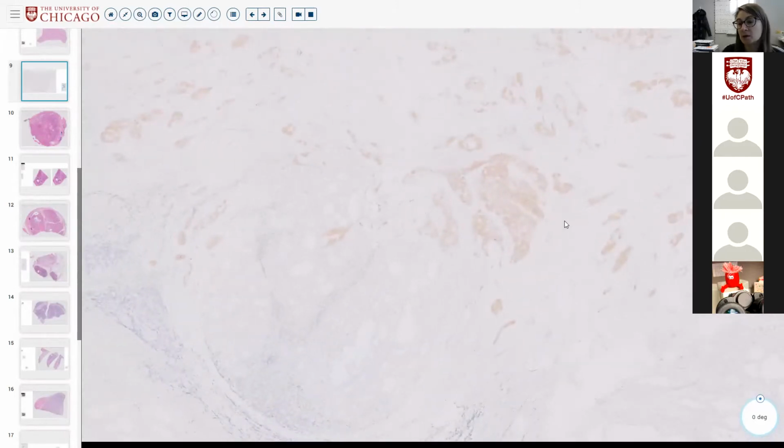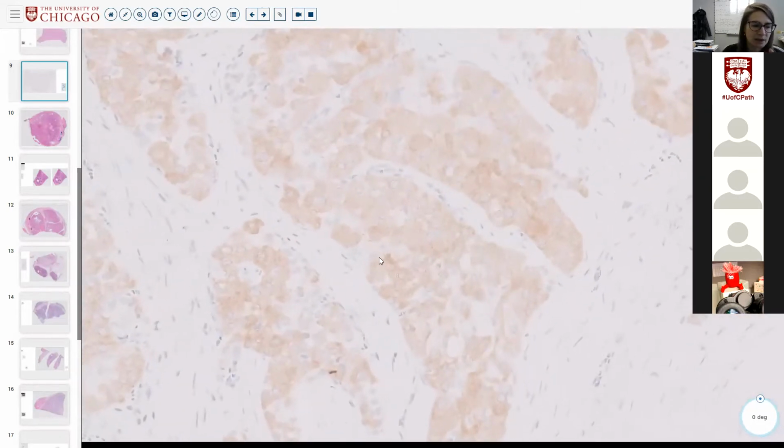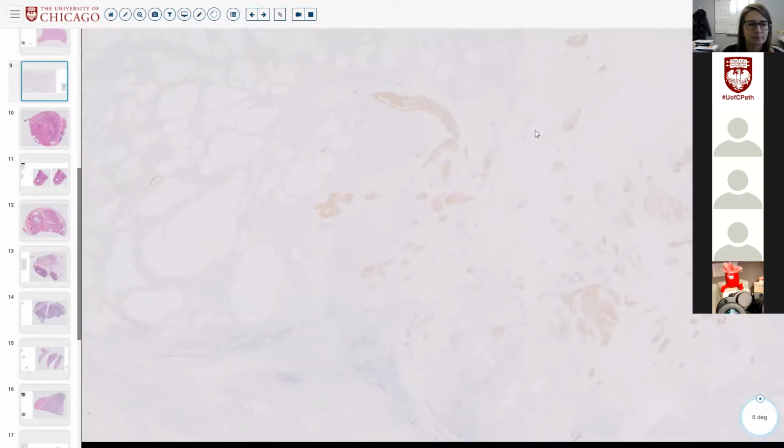I think I saw an inclusion elsewhere. Yeah, you probably did. If we looked hard enough across the whole tumor, I'm sure we would see an inclusion, but this is BRAF, and how do you interpret it? This is enough.